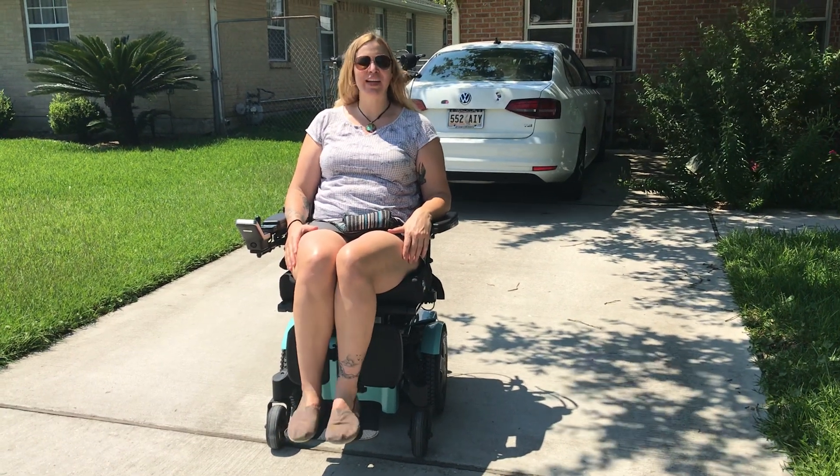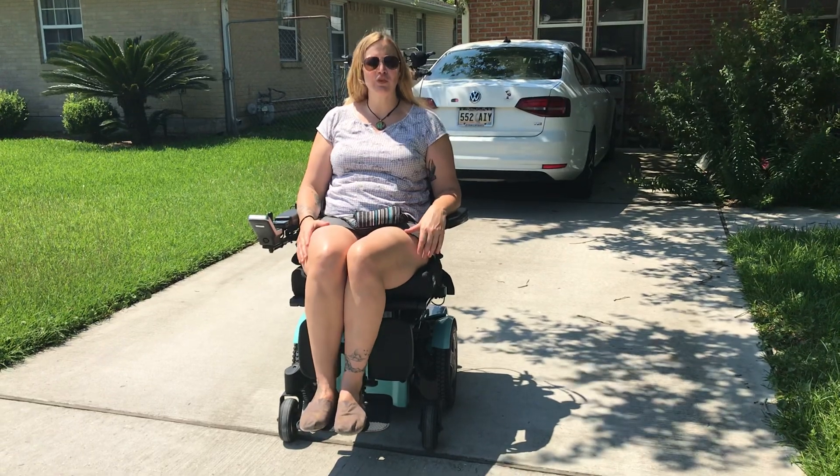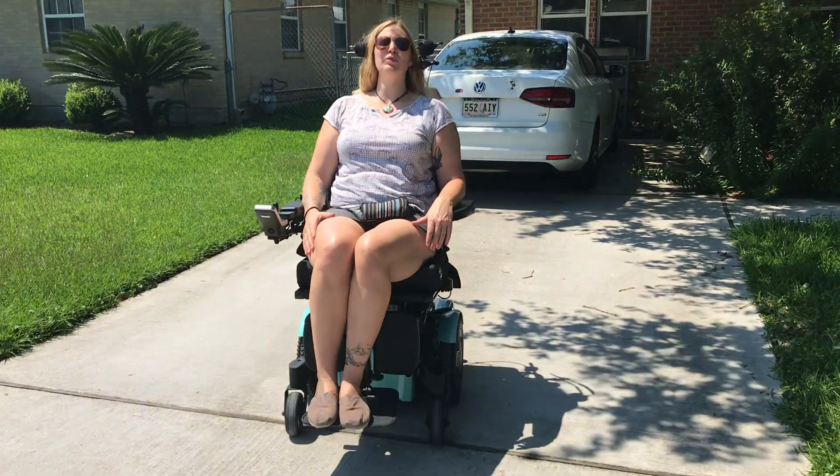Hi, this is Joy, your assistive technology professional, and today I want to talk about a type of alternative drive called the proportional head array. It's by ASL Laboratories.